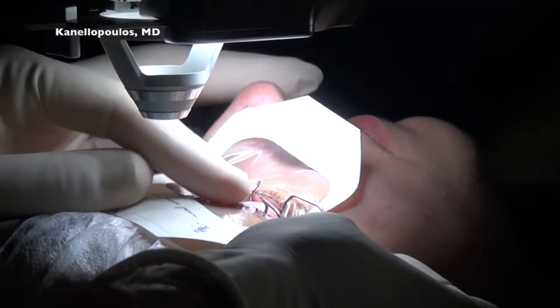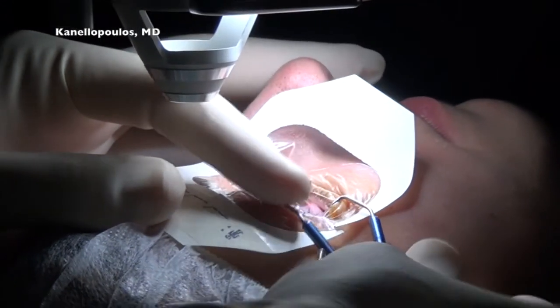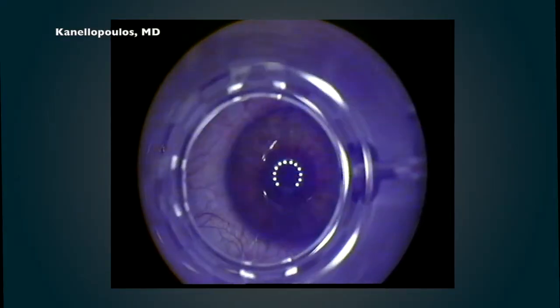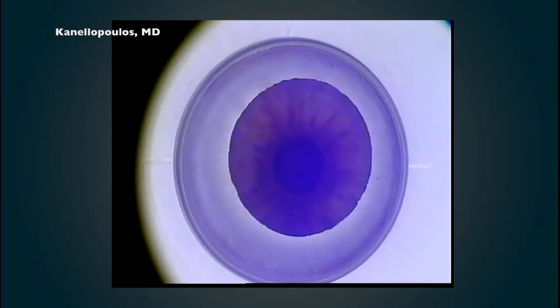This is really great filming by our friend Paolo from Milan, and we're seeing some great images now. We're looking at the surgeon's view and how the ring is placed slightly superior. You see the scleral crescent inferior to our picture is more prominent. I'm rocking the PI slightly across the eye to have it adhere to the conjunctiva. Engage suction on the suction ring that I had placed on the patient's cornea.